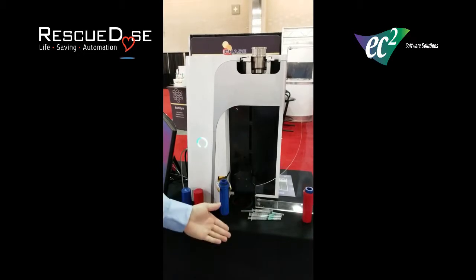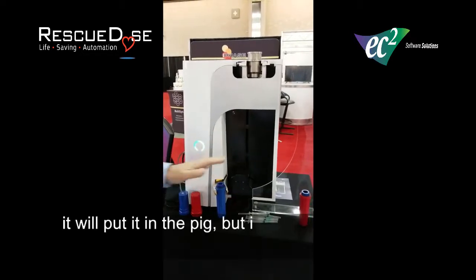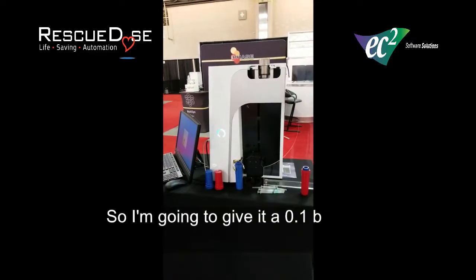Coming down, it puts it down into the dose calibrator. If everything checks out, I'll put it in the pig. But in this particular case, I'm going to say it needs to do an alteration, so I'm going to give it a 0.1 boost.